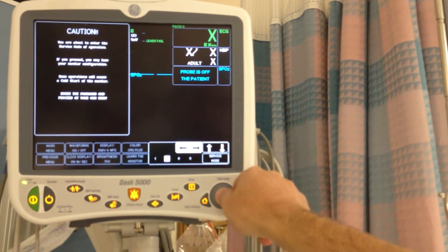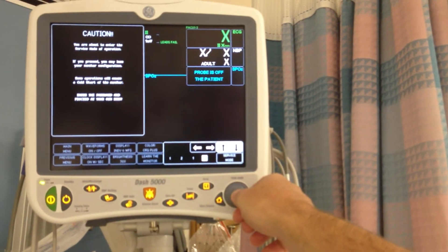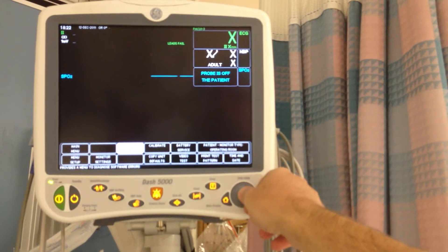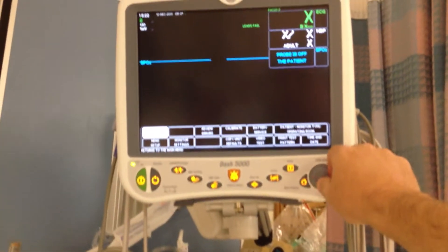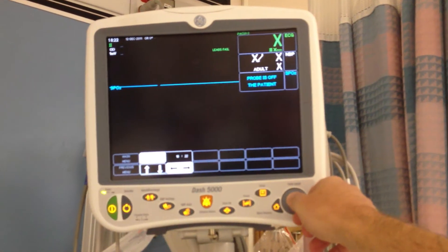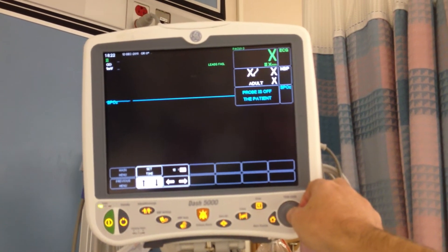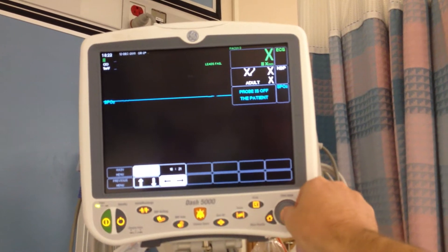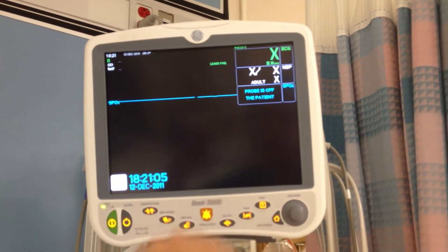For 12-12 the day and today's month 12-12. We're going to change the time and date — just to show you, we're going to make it 18:21. We'll say set time and main menu. There we are, 18:21.